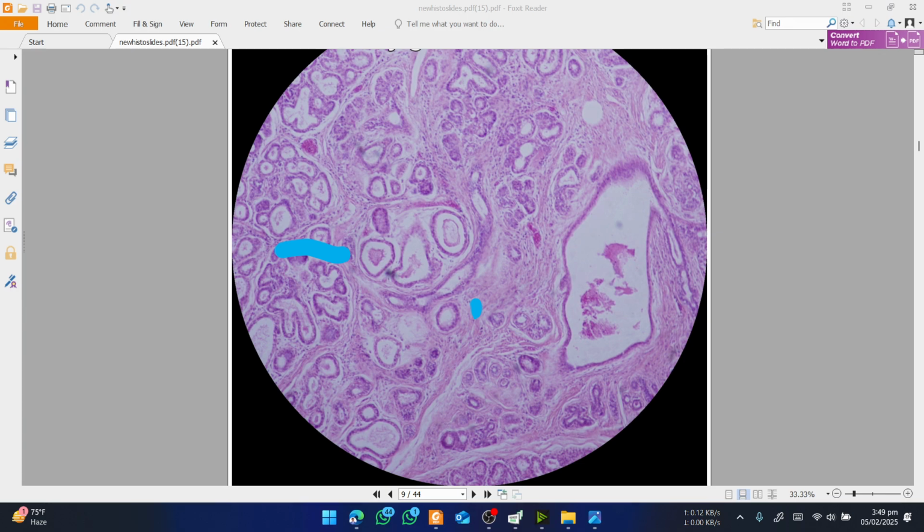Depending upon the, okay, you will see these lobules, and in that the secretory component will usually be cuboidal and sometimes milk component that is present inside them. So these are the things that will help you figure out the mammary gland. Okay, now moving on.